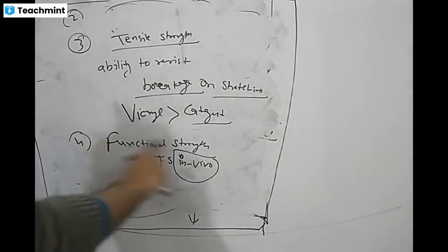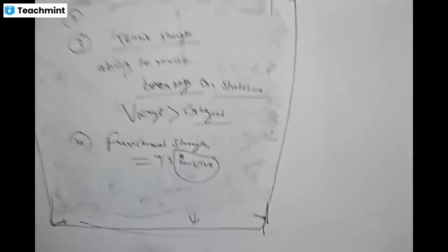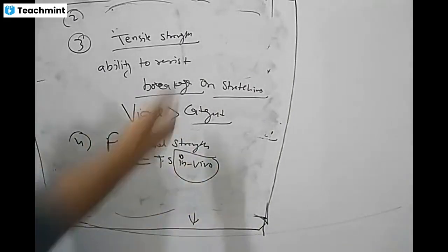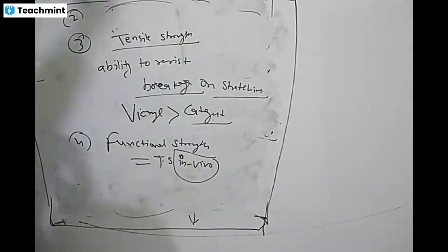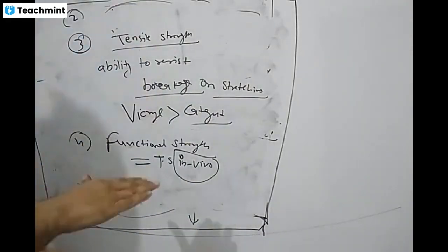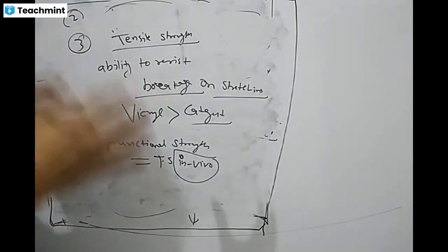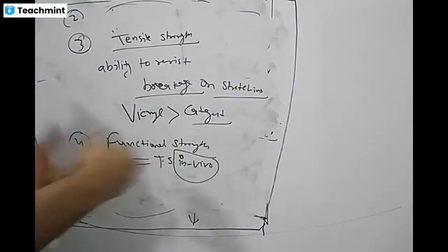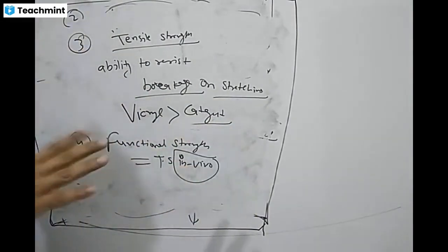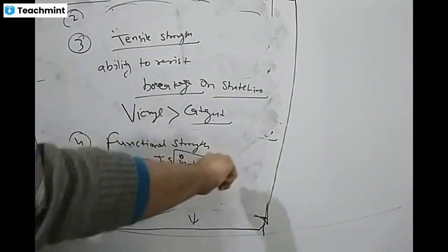If you have applied your suture material on the linea alba, suppose you are doing OHE and you close the linea alba, then because of gravity and the weight of the intestine and other organs, the material starts pulling, and because of that pulling, the catgut will break down.